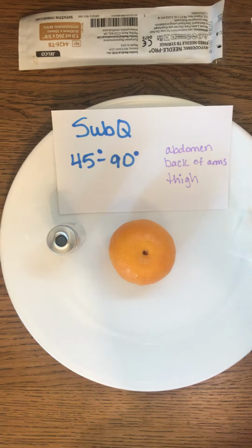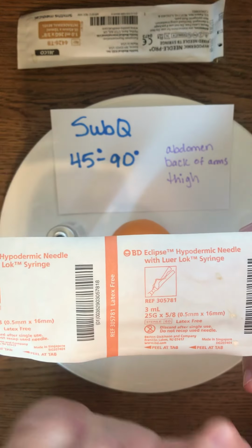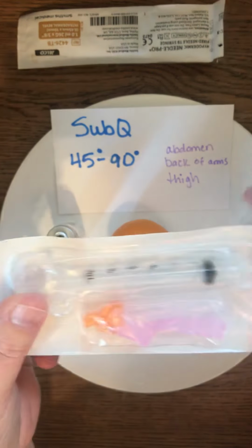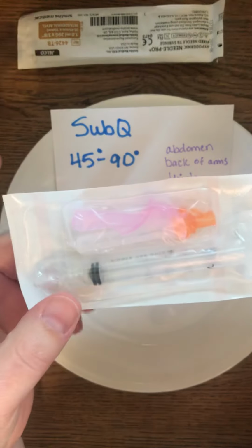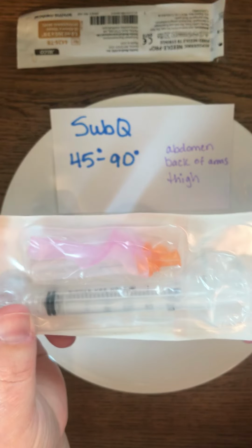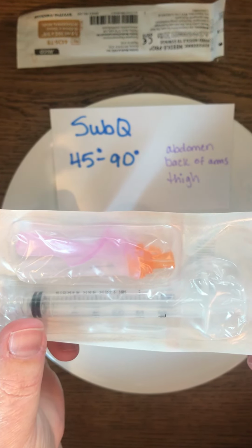So again, here's our syringe. And again, this is a 3 ml syringe. And you can see it's a 25 gauge and it's a 5/8 inch. So as you can see here, when you have packages like this, the needle is separate from the syringe. So we do need to hook them up together. Now remember, we want to keep this as sterile as possible because we're going to be puncturing somebody's skin and we want to decrease the chance of an infection.